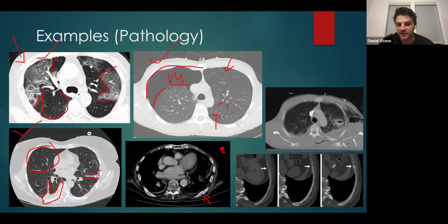And you can also see fractures better. In the bottom right, you can see a specific plane of fracture, where you can see the fracture from different angles. I included this because it's a good example of what fractures look like at different angles. And we talked a little bit about evaluating the subcutaneous tissue. If you look at a fracture, you want to also make sure that you look at the subcutaneous tissue because sometimes patients can have subcutaneous emphysema. And if that's the case, then they might have a hemothorax or potentially a pneumothorax. There you can see the hemothorax, or the pleural fluid.